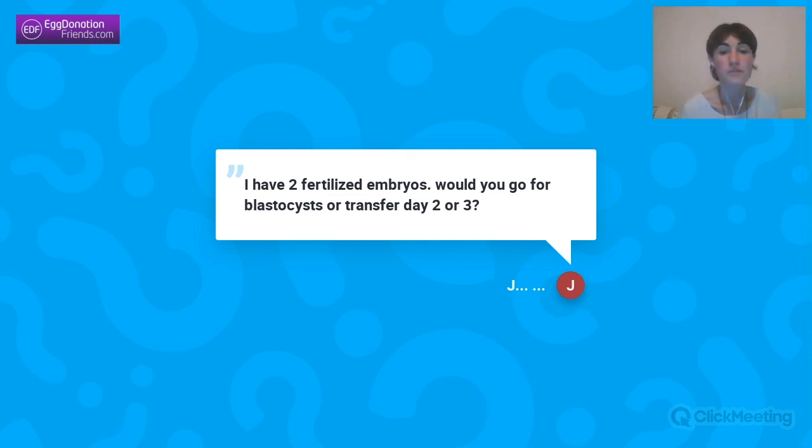But some people prefer to transfer blindly. Some people say, psychologically, I do not want to see if it reaches the blastocyst stage or not, I just want to transfer it blindly. We can respect that. But personally, I think it would be better to leave it to blastocyst stage because, like I say, if it does not reach the blastocyst stage in the laboratory, it will not reach the blastocyst stage inside of you.